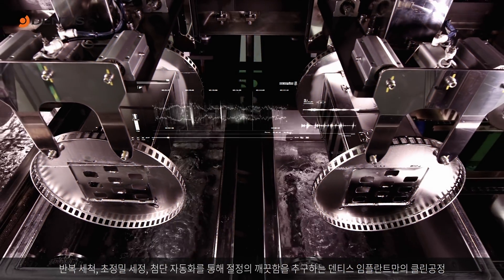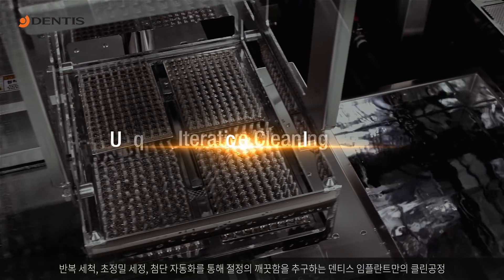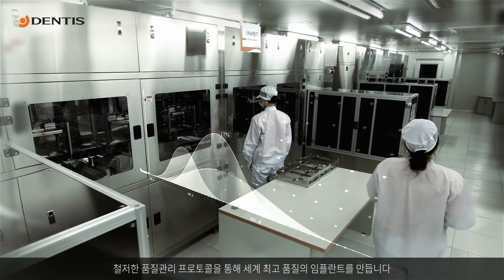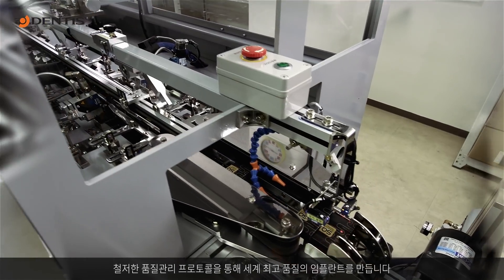The DENTIS implant cleaning process ensures maximum cleanliness through iterative cleaning, ultra-precise cleaning, and fully automated systems. The world's best quality implants are produced through the most rigorous quality management.